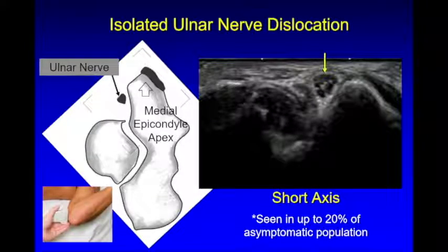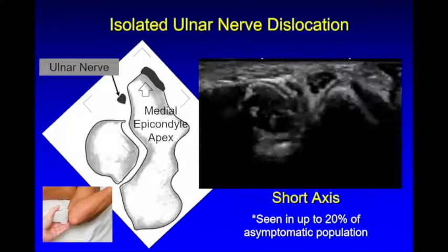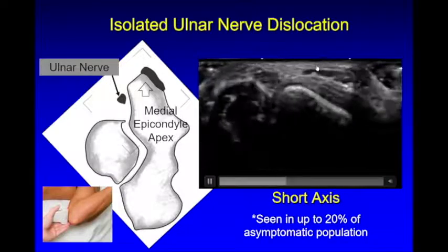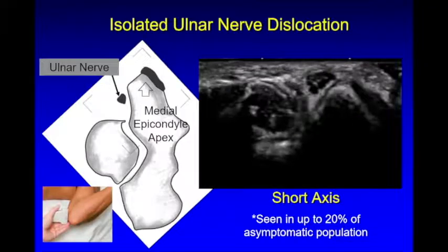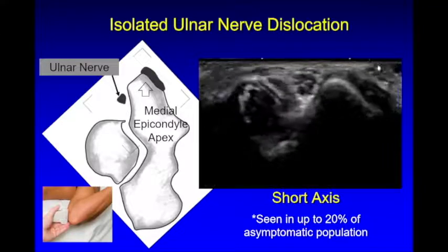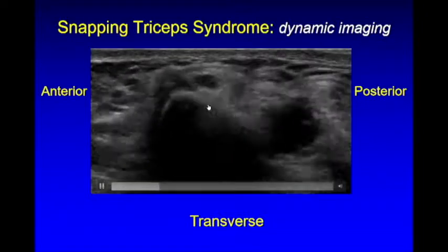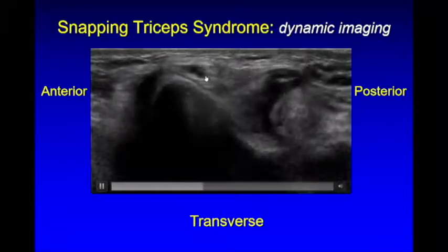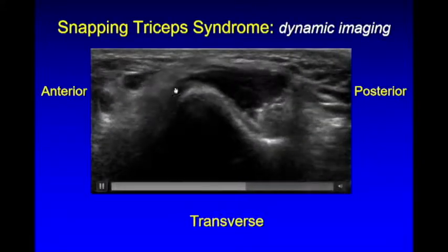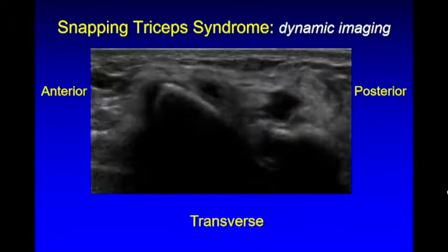Regarding dynamic imaging of the ulnar nerve: normally when we flex the elbow, the nerve should stay behind the epicondyle. In the abnormal situation, the nerve will come out anteriorly. This occurs in up to 20% of the asymptomatic population. When scanning here, don't put too much pressure with the transducer, as you can inhibit the nerve from snapping back and forth. This must be differentiated from snapping triceps syndrome, where the nerve dislocates but the triceps also shows subluxation. Here with the elbow in neutral the ulnar nerve is in position, and on flexion there are two distinct snaps as the triceps comes over and then slides back.